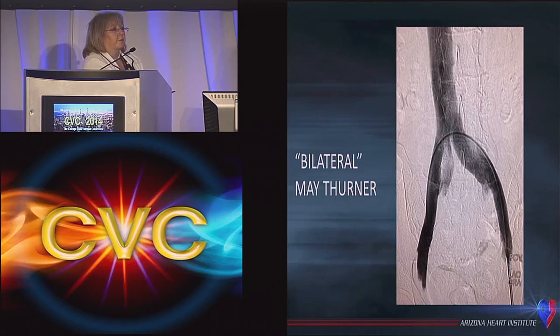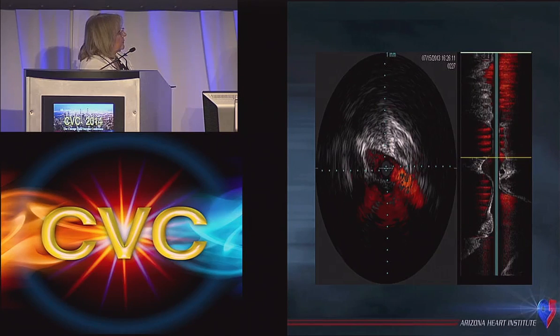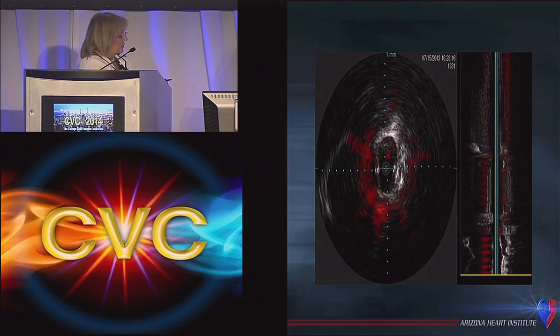There are, in the literature, it says about 2% of people have a bilateral May-Thurner. I think we see it more often than that, but this is a case in which there is indeed flattening of both sides from the aortic bifurcation of the vein crossing over. So both sides of that need to be stented. We saw some pictures from Dr. Bjornson of what I call a double May-Thurner, but it's a double vessel. It's almost like you have 2 iliac veins on one side. These are the images from the IVUS in this patient. Very narrow in each channel.